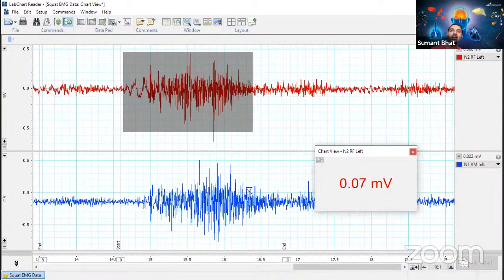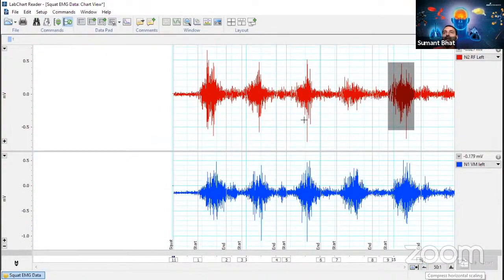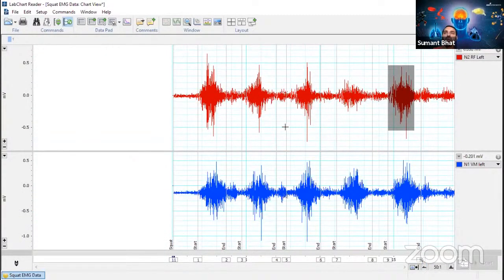Of course we can take an average, but the problem is the signal is bidirectional in nature. The positive amplitude and negative amplitude will be almost equal in the EMG signal, so when you take an average it becomes close to zero. That zero is meaningless because we want to get some change before and after. So averaging is not a good idea. Let's see what options we have in the lab chart to analyze the data.